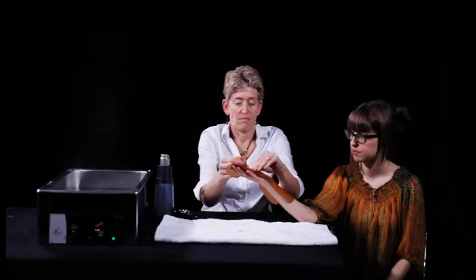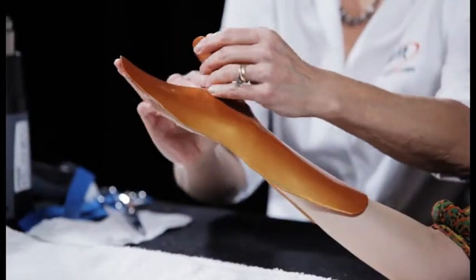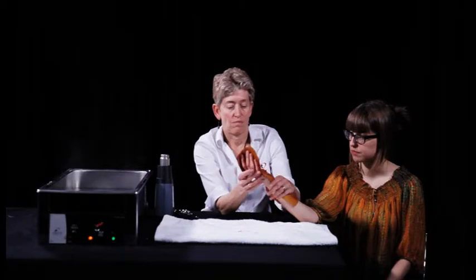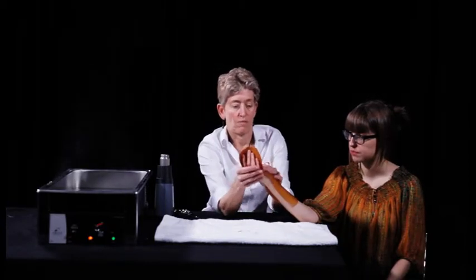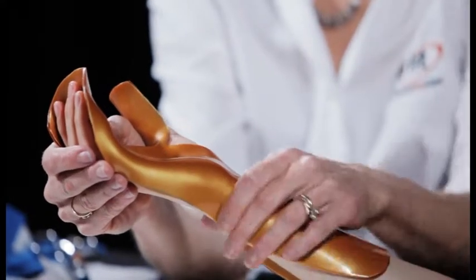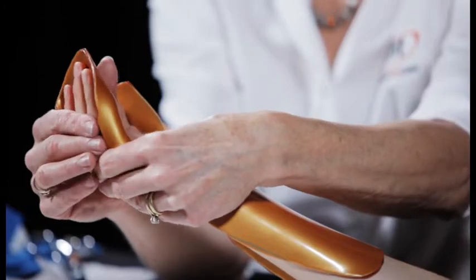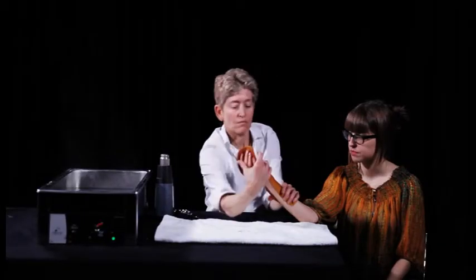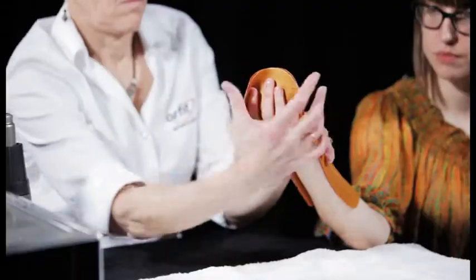Place the orthosis over the patient's hand, wrist and forearm, letting gravity assist. Stretch the material onto the first web space so that it conforms and offers support to the thumb and index finger. Smooth the material down the forearm, stretching it slightly to help it conform. Do not pinch tightly in any one spot to avoid fingerprints and pressure points.